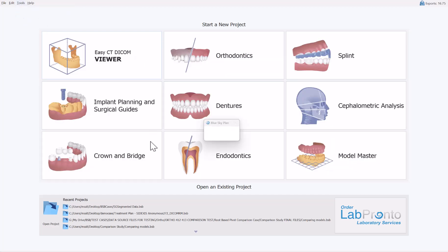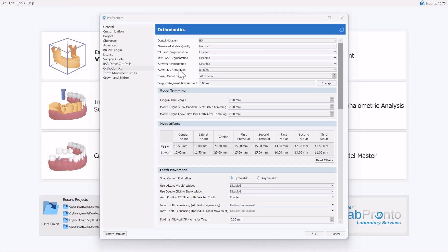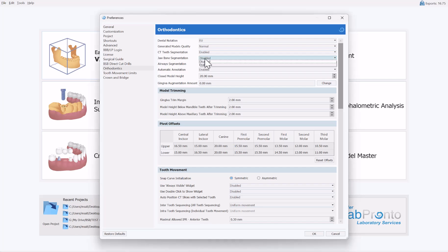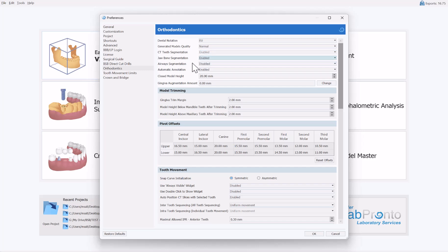Going to Tools > Preferences, the CT tooth segmentation is enabled by default. We also have additional options for jaw bone segmentation, which is disabled by default to reduce processing time, but it is highly recommended to enable it so you can see tooth and root movement in the actual jaw. Airway segmentation is also disabled by default, but you can click on it and enable it to run during the CT segmentation process for the aligner digital tooth setup.